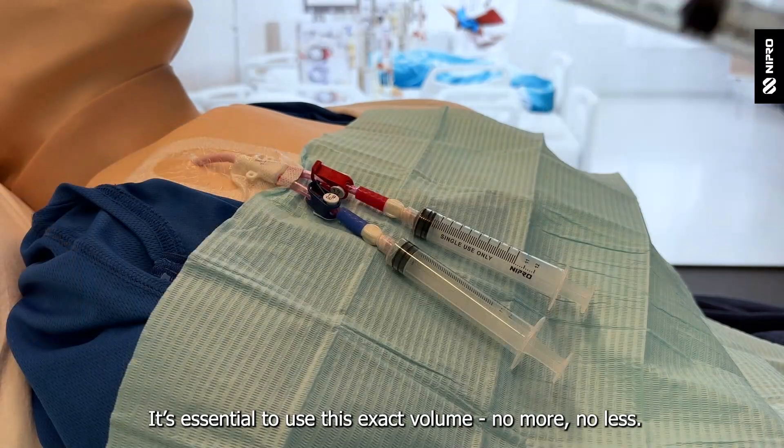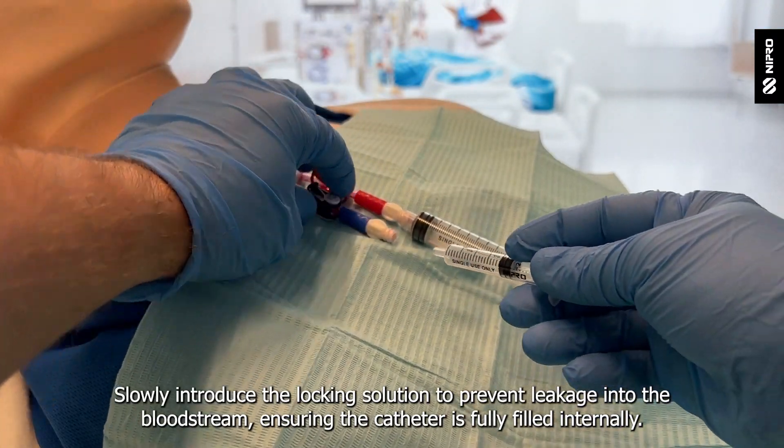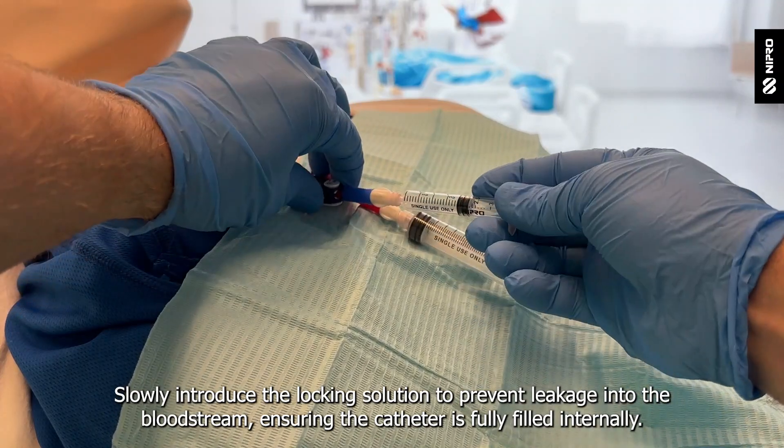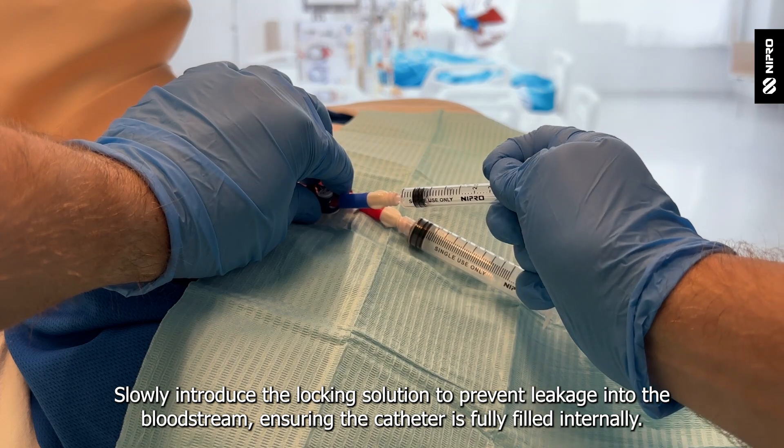It's essential to use this exact volume — no more, no less. Slowly introduce the locking solution to prevent leakage into the bloodstream, ensuring the catheter is fully filled internally.